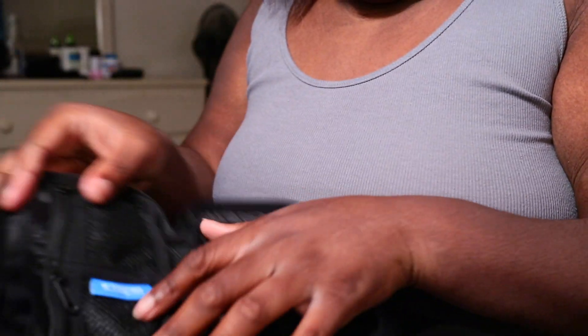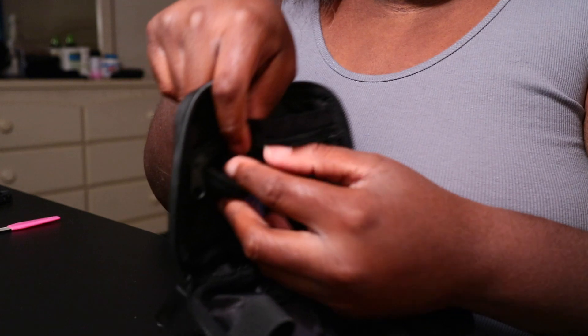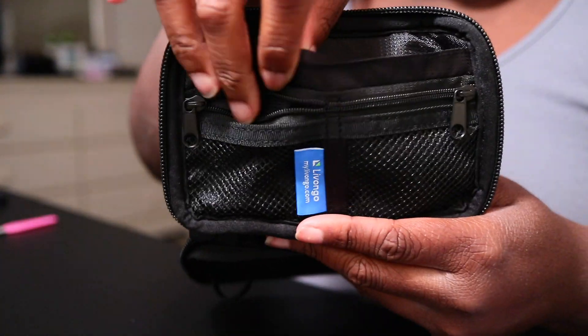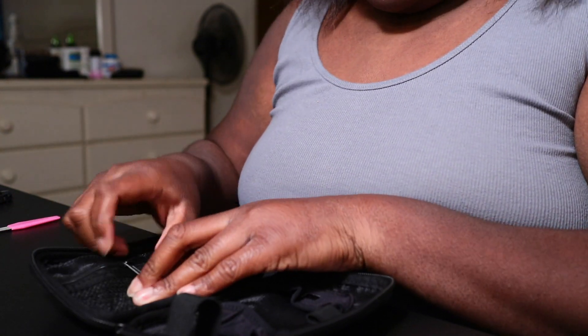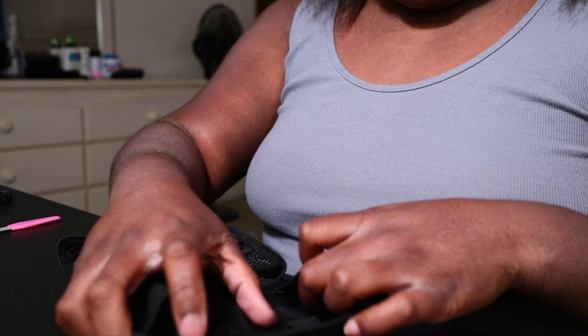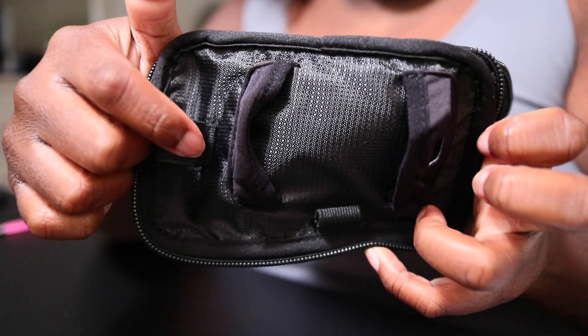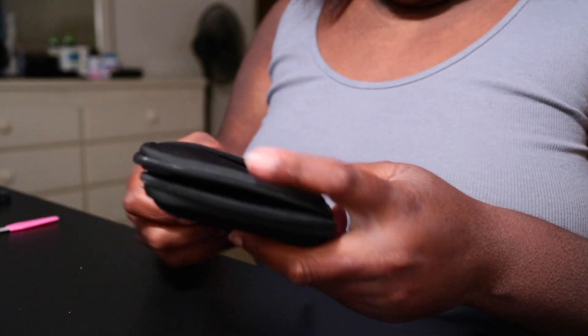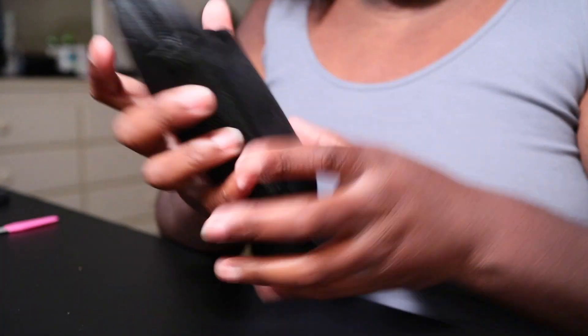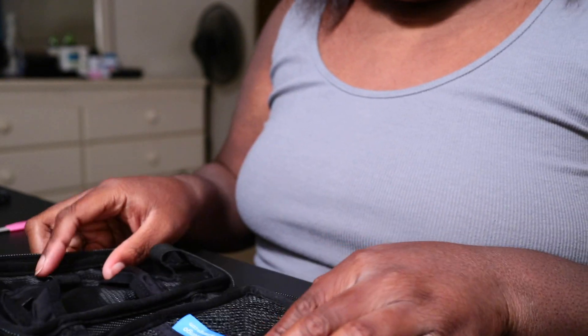So you got a pocket right here, and then you have two mesh zipper pockets. On the other side you have where you put your lancing device and your test strips, and then you have a pocket on the front. This is a very soft and premium case — I really do like this.